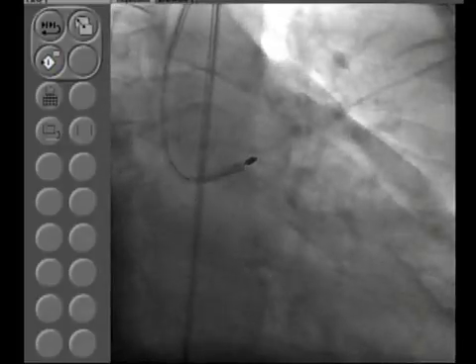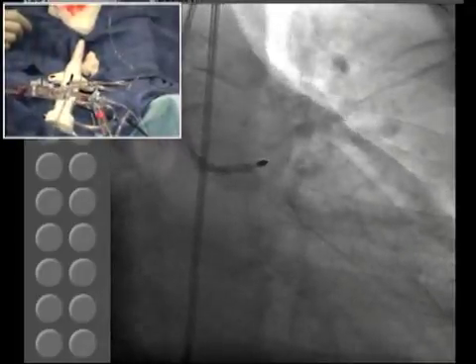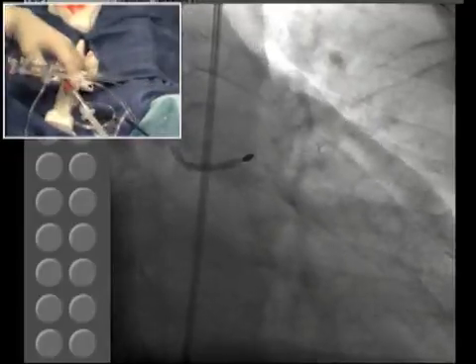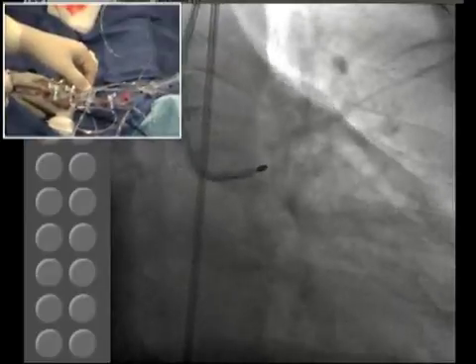And the last one is when you are on Dyna, just do a tap. You see that the burr never moved. If there was any tension still present, the burr would have moved, but with a very small RPM. Now we are ready to do the rota.